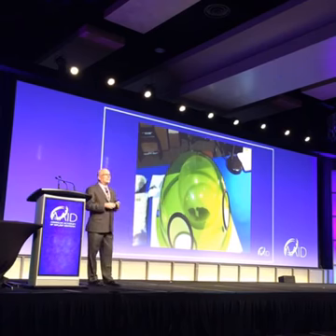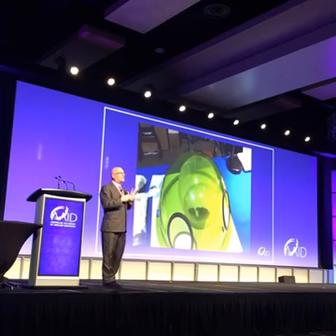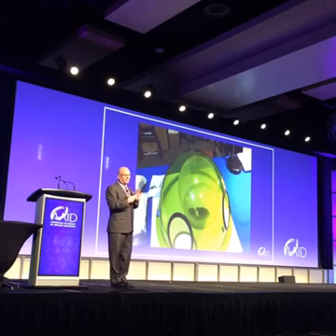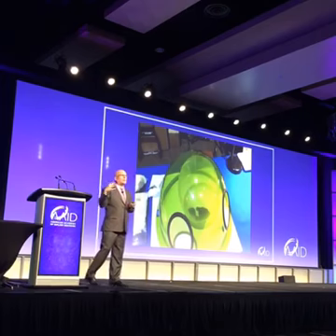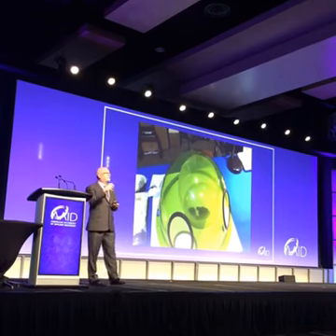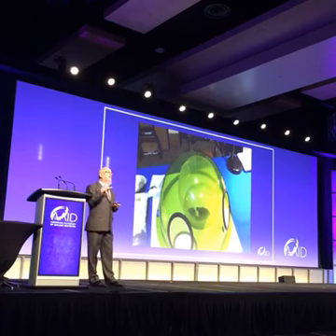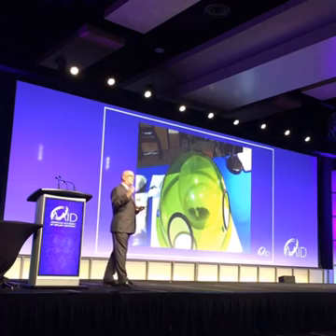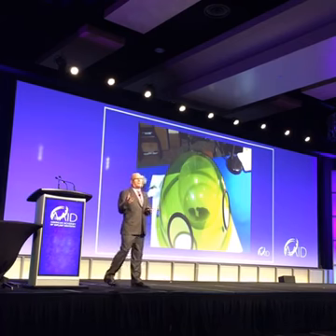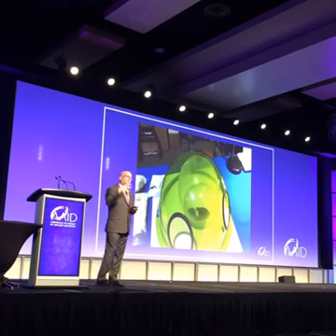The idea is that if it's absorbed in water, it has a very low penetration. It can't penetrate deeply, because once it reaches that first layer of cells, it's done, it can't really go any further. It's highly absorbed in hydroxyapatite. Well, hard tissues, that's great, because erbiums were initially developed to treat teeth, to do cavities and to cut teeth. It also cuts bone. If I'm treating perio, do I want a laser that cuts bone? No, I want to keep as much bone as possible. So an erbium really is not the laser that I want to use to treat perio.